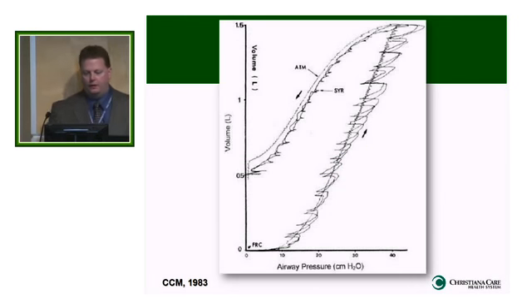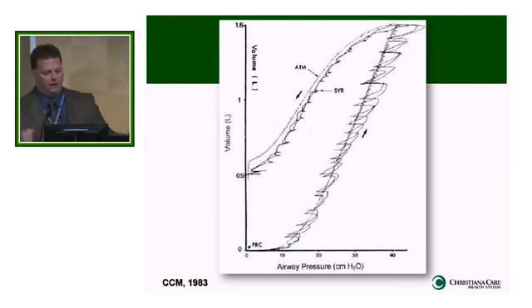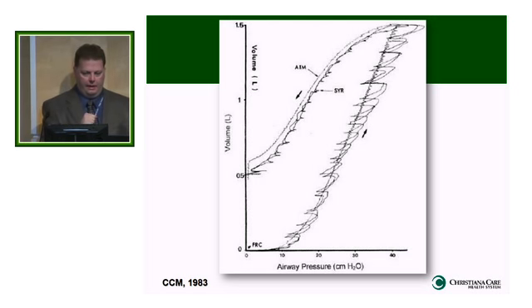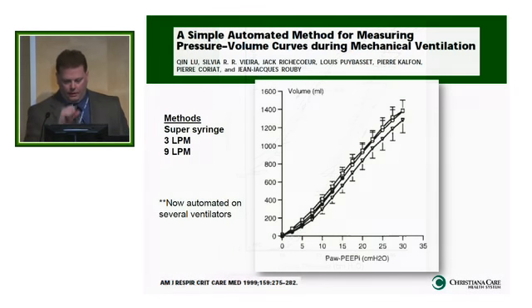This is one that is live, computer done, and you can almost see the jaggedness of them putting the volume in and then letting it sit for a second, then putting the next set of volume in, and you can map out the lower inflection points and upper inflection points after you massage the data just a little bit.